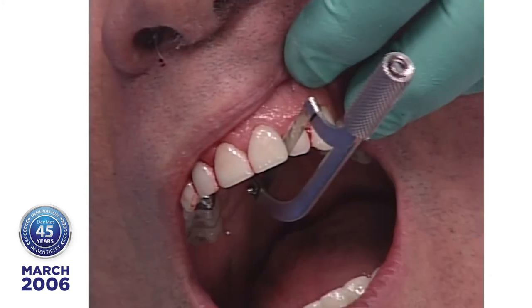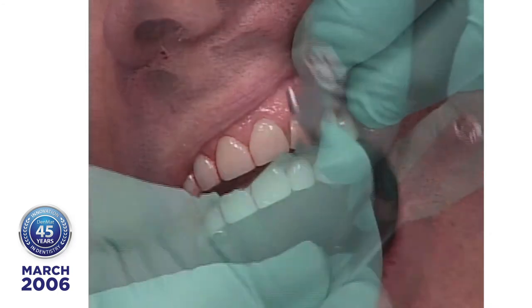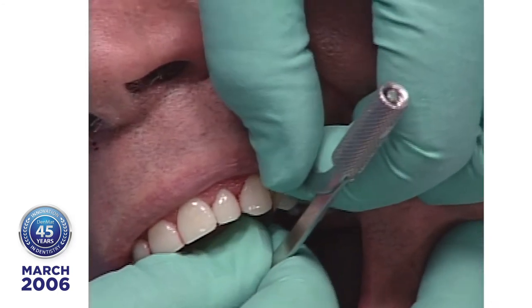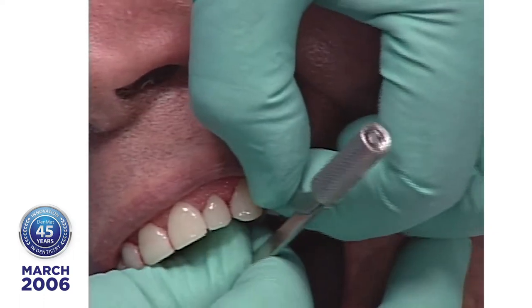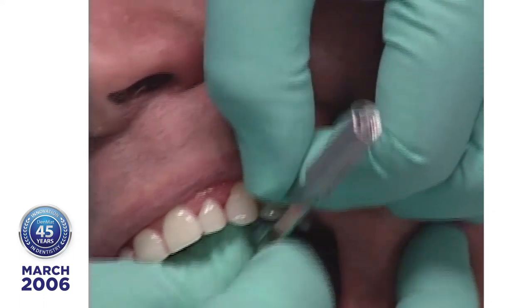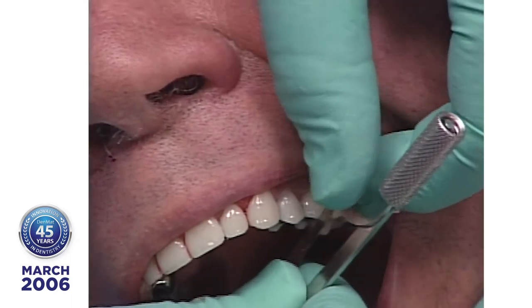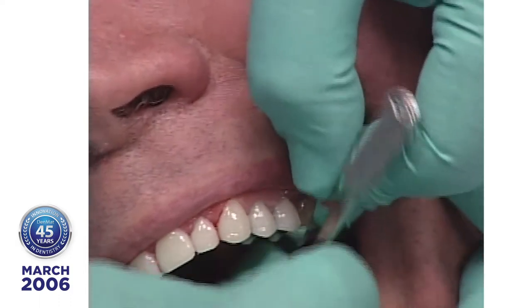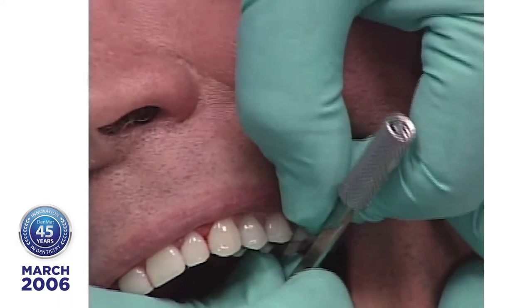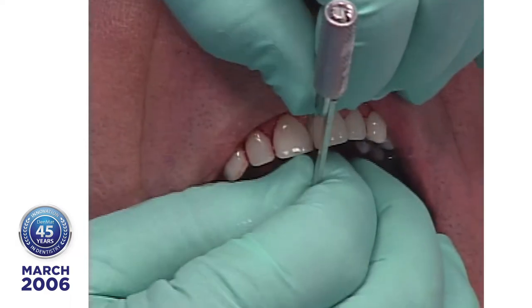And if it gets a little tight on the going through, then we stop and we just rock it. Some of these contacts are really opening nice and easy. Now you're wondering about the lowers, but they open the same way if you take the ultrabond out first. If I get into a tight spot, it's because I still have too much ultrabond in there. And then I just rock a little bit. But so far, I've opened almost every one I've tried to open.